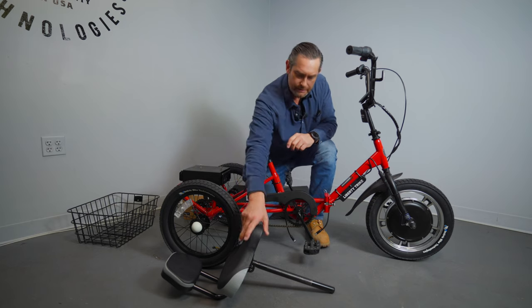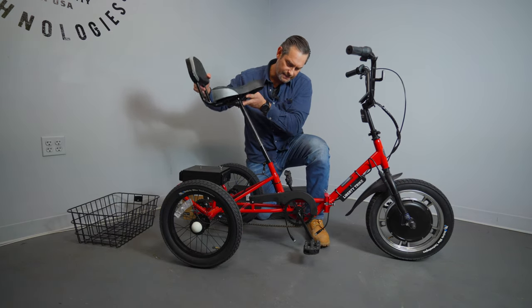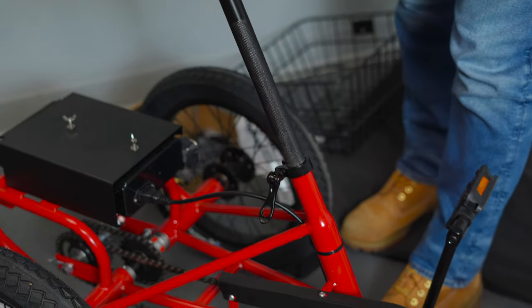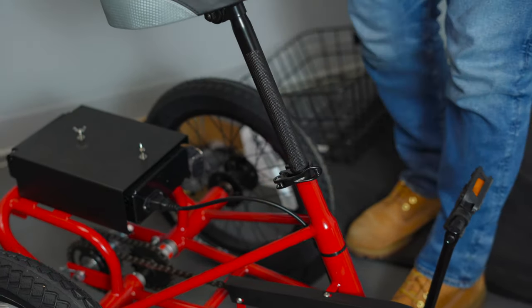Now you're done with the front of the trike. The next thing is going to be your seat. Go ahead and pick up your seat, place that into the seat post into the stem, and then lock that up. We can do final adjustments later.